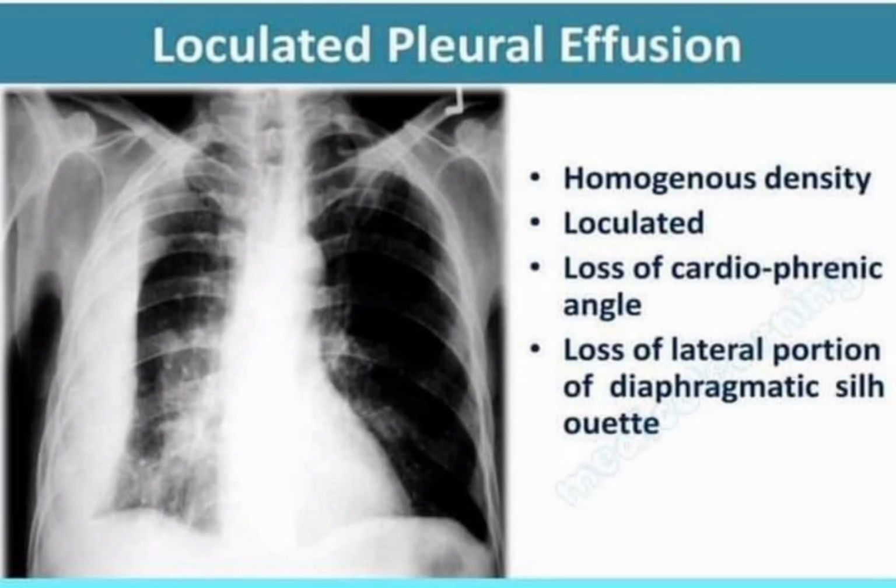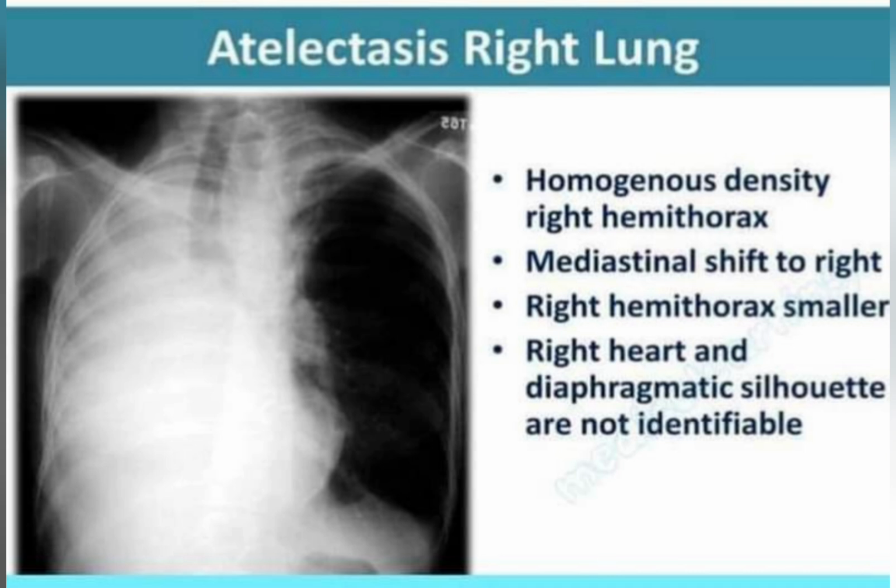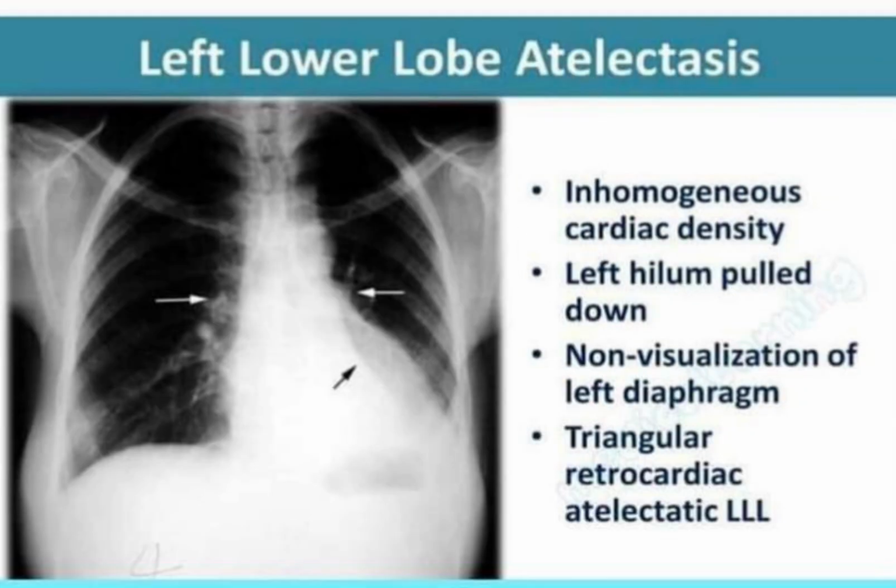Broken bone. Hardening of a heart valve or aorta, calcification. Tumors or cancer. Diaphragm that has moved out of place, hernia. Inflammation of the lining of the lung, pleuritis. Fluid in the lungs, pulmonary edema, which can mean you have congestive heart failure.